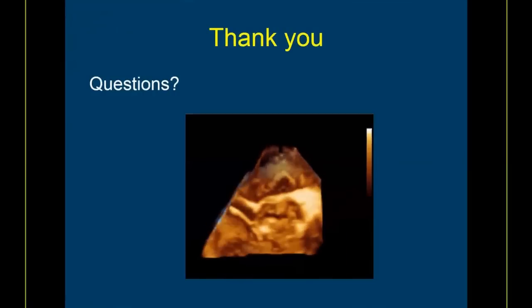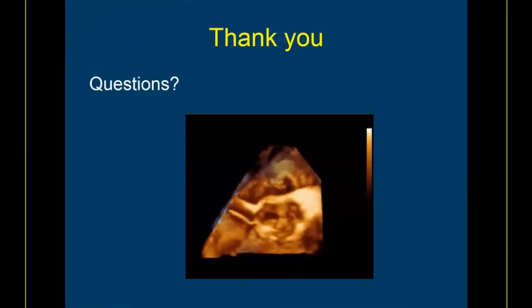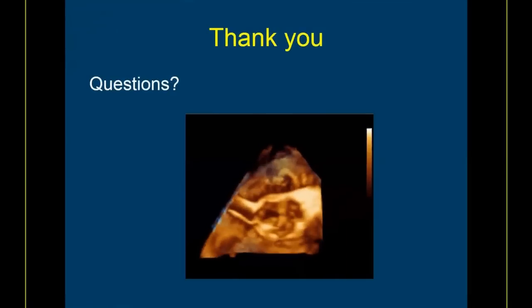However, sometimes you can't always get that, for technical reasons. If you have a nice, crisp V1 envelope within that V2, and you have confidence that it's a nice parabolic envelope, it's reasonable to use if that's all you have. That's been my approach anyway.